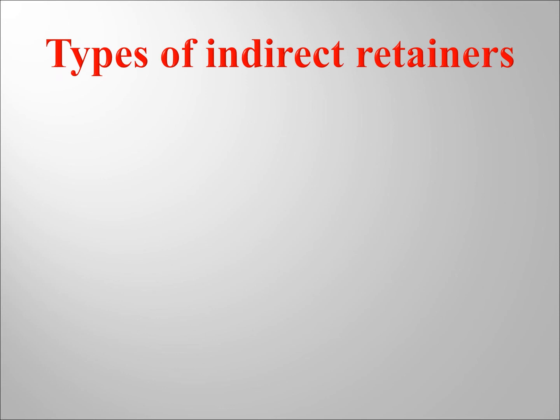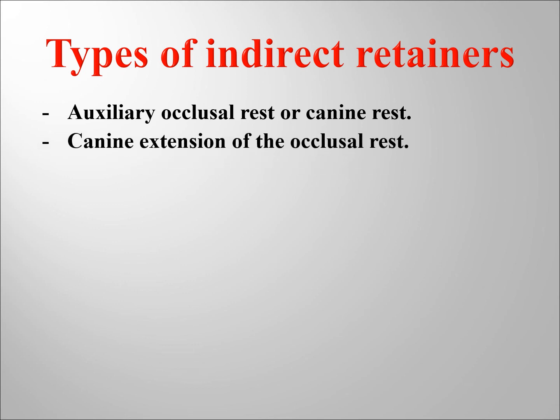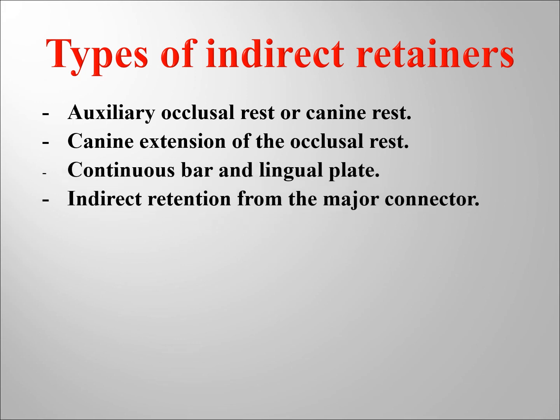Now, there are a few different types. They can be auxiliary rests or canine rests, a canine extension of the occlusal rest, a continuous bar and lingual plate, or indirect retention from the major connector, from the rugae support.